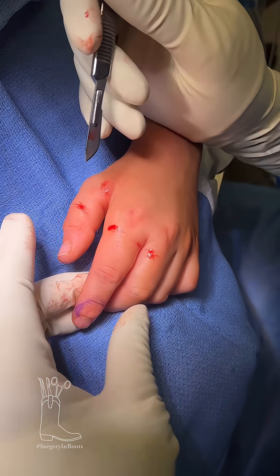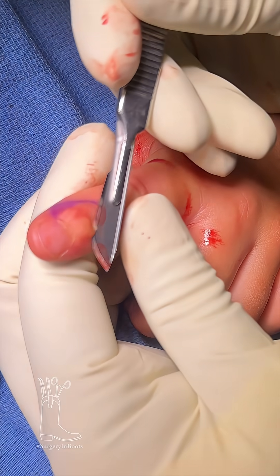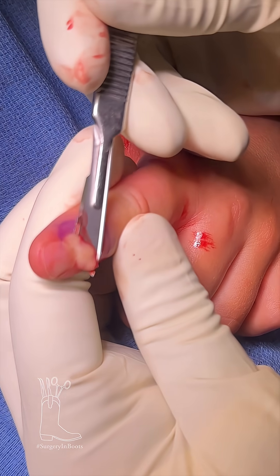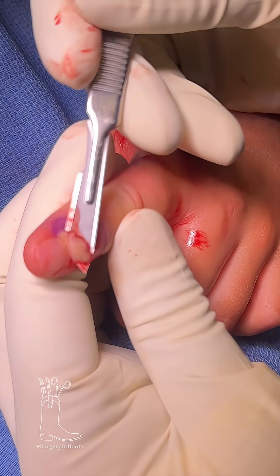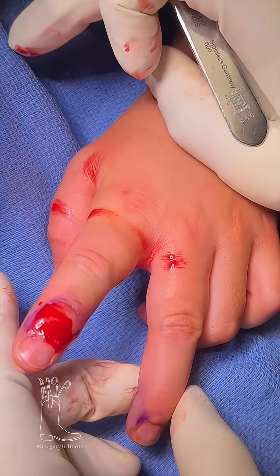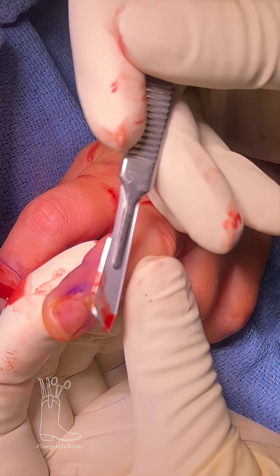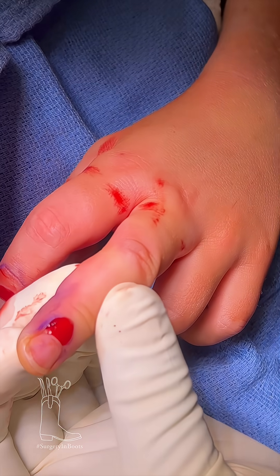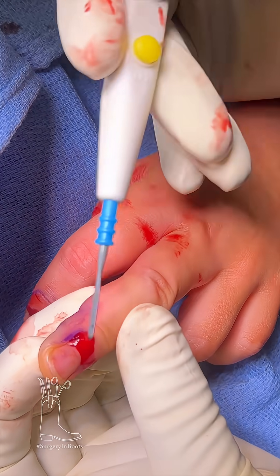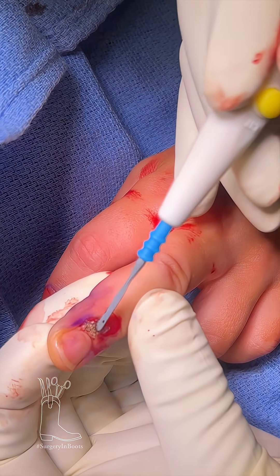So this is pretty much how we remove warts. We call it an excision and fulguration — fancy doctor talk for cut it off, burn it off. Here what we're doing is using a number 10 blade to shave this wart off of his finger. I think this is the best way to get it off, and the main reason is you'll see once we get all of these shaved off, it makes it a little easier to do the fulguration part — essentially just because we have removed all of the extra tissue.